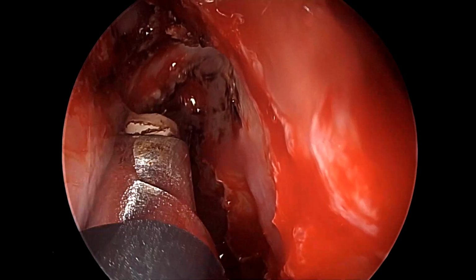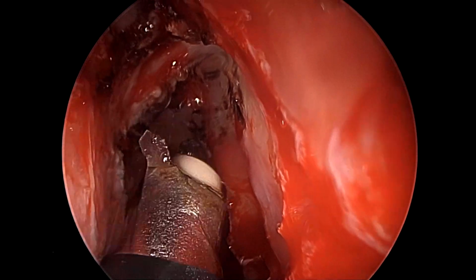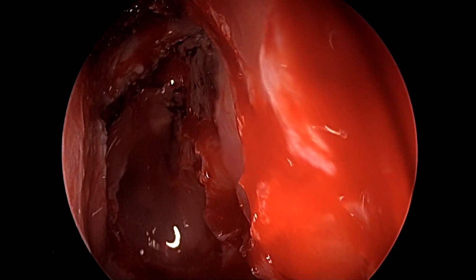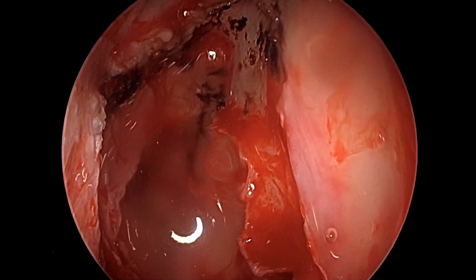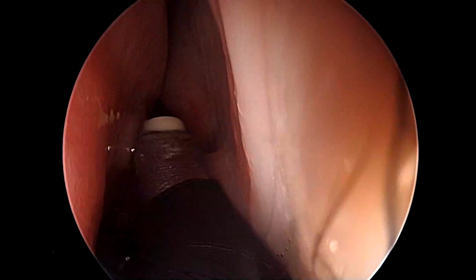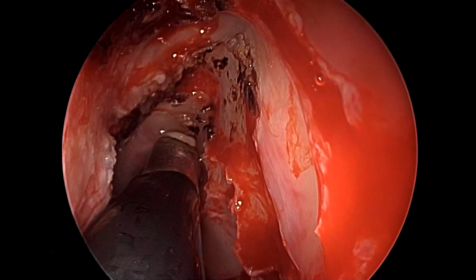Also, since the defect size is small, we would need to enlarge it slightly with blunt instruments before we can place a graft material. It is nearly impossible to shove a graft material through a very small defect. So even if the defect looks small, it is important to ablate much more mucosa around it and create a fair amount of flush bone without any septations for adequate reconstruction preparation.